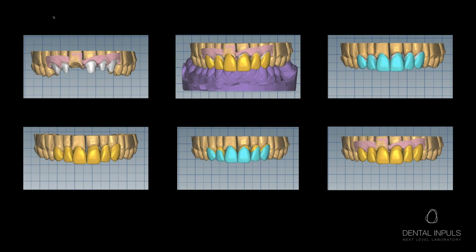Third, proceed with adaptation of library to the stumps. Number 4, go to expert mode, choose add remove mesh. 5, import the setting of the tooth as a pre-op or a wax-up. And 6, adapt to pre-op.